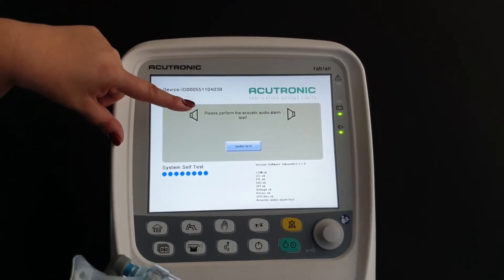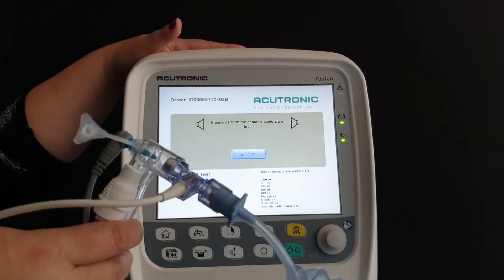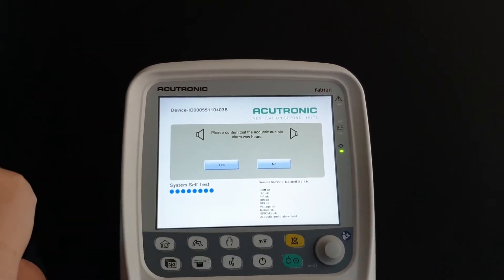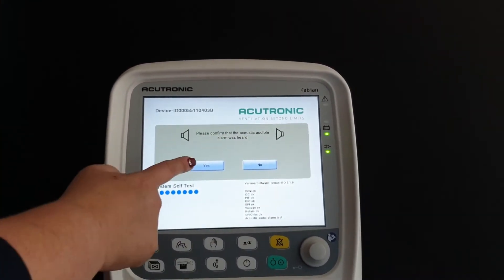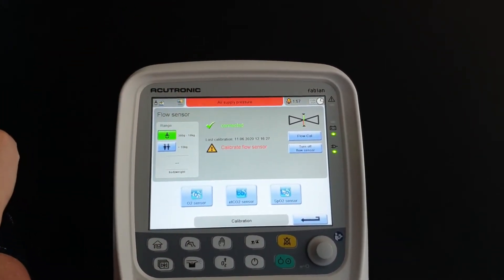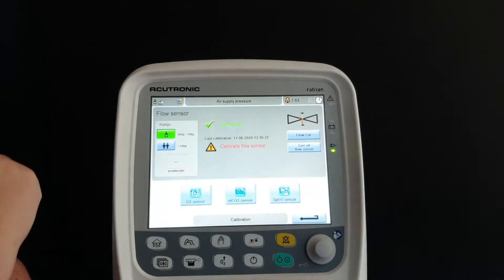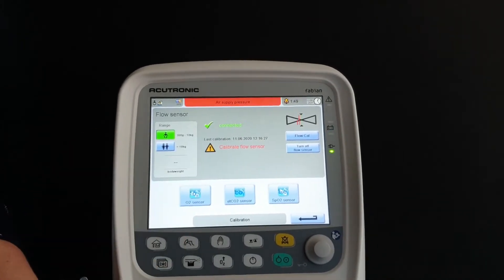The machine says 'Please perform the acoustic audio alarm test.' This is very important — you have to tell the machine that you can hear it. Press 'Yes' for the audio test, confirm you can hear it, and the machine will automatically take you to the flow sensor calibration system, which says 'Please calibrate the flow sensor.'